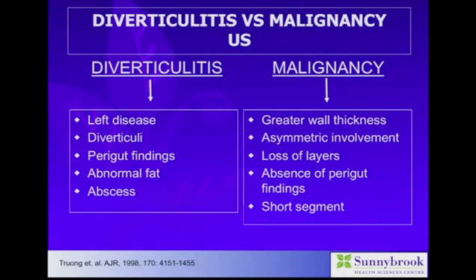The peri-gut findings are helpful. Inflamed fat, fluid, collections, etc. are more likely due to diverticulitis. The caveat to that, of course, is a perforated malignancy.